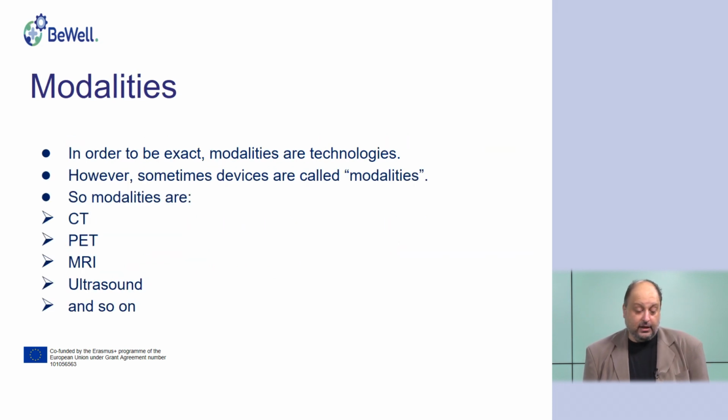The modalities, of course, are not supplied with the system, although manufacturers of modalities usually provide and may offer the PACS system. Sometimes some people consider devices as modalities. This is not correct. The modalities actually are the technologies.